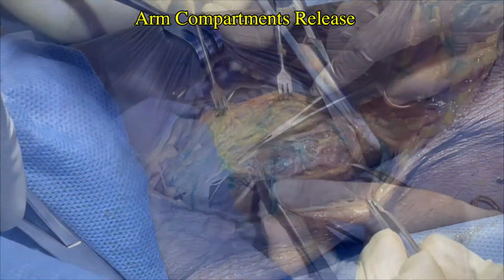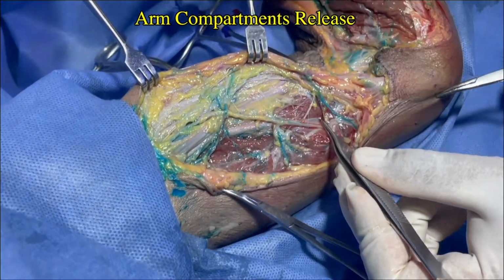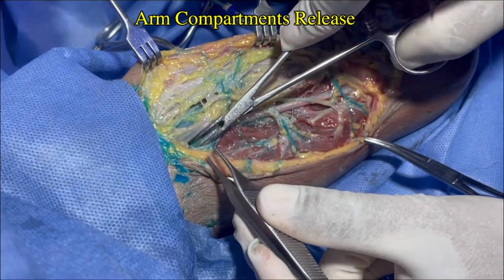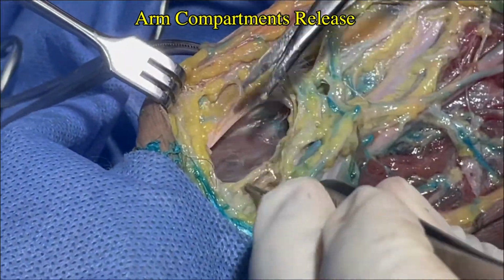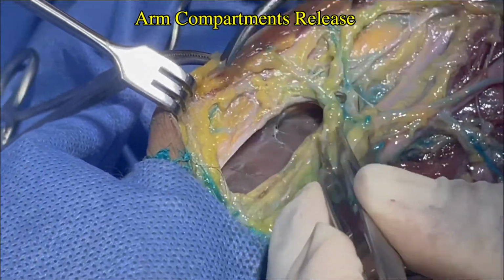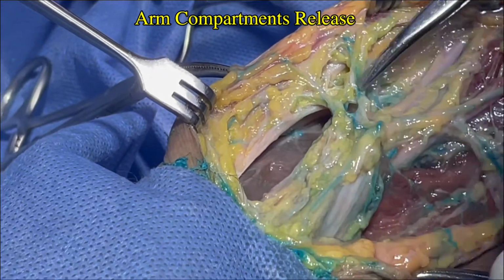Through the medial approach, identifying the reference of the intermuscular septum, it is possible to perform the release of both the anterior and posterior compartments as shown in the images. As the dissection progresses, the medial cutaneous antebrachial and medial cutaneous brachial nerves must be identified and cared for.